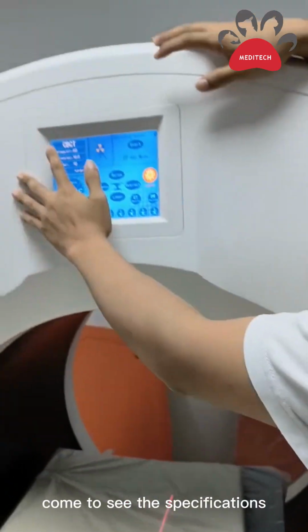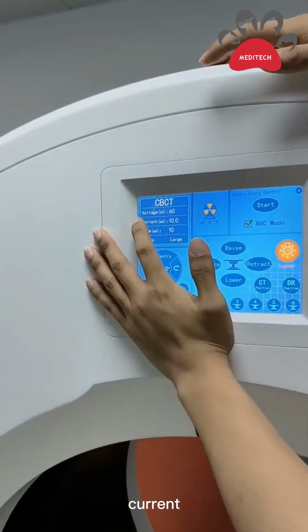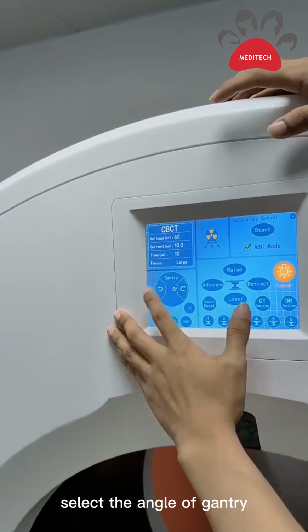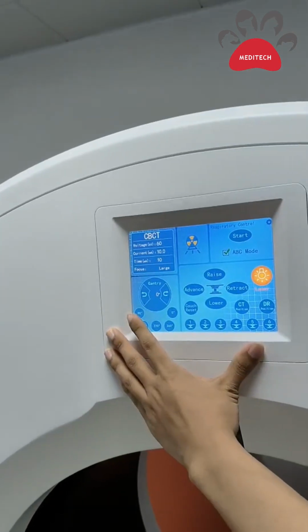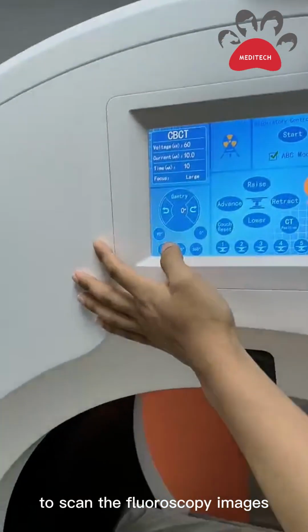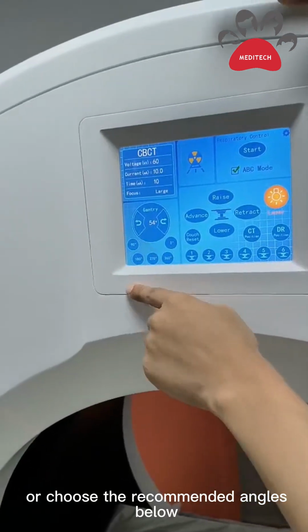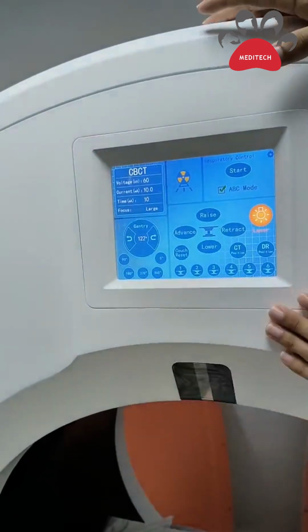Next, come to see the specification: voltage, current, and exposure time. We can adjust the values in the software. Select the angle of the gantry. In fluoroscopy imaging mode, it needs different positionings to scan the fluoroscopy images. You can adjust the angles by yourself, or choose the recommended angles below. That's for recommended angles.